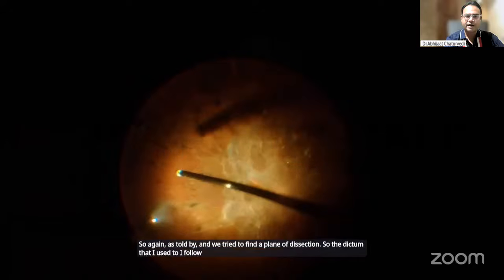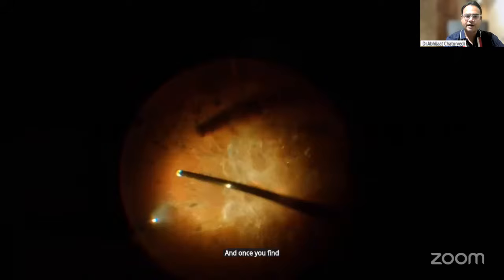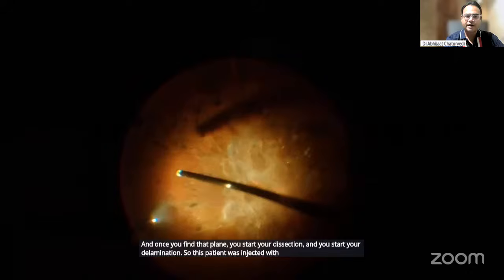The dictum that I follow here is that you just nudge or insinuate your cutter below the membrane, slightly elevate the membrane, and once you find that plane, you start your dissection and your delamination. This patient was also injected with an anti-VEGF 3 days prior to the surgery, just to avoid very bad bleeds.